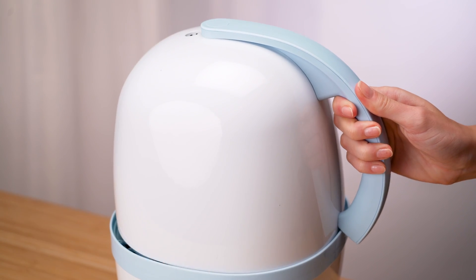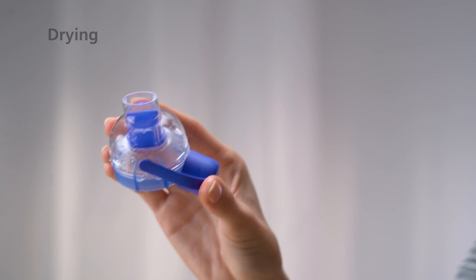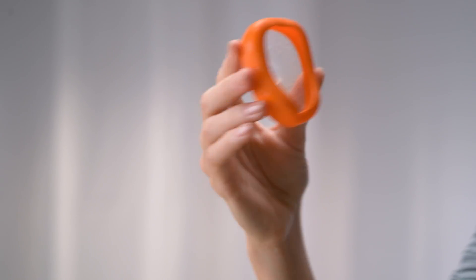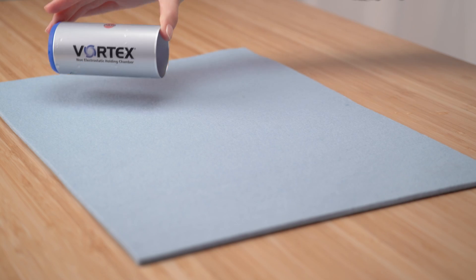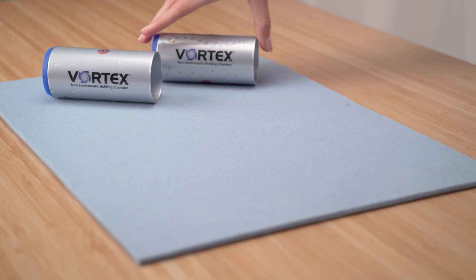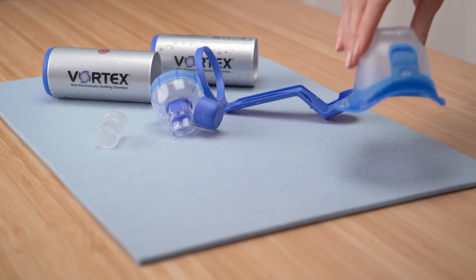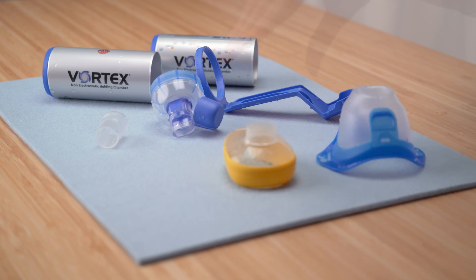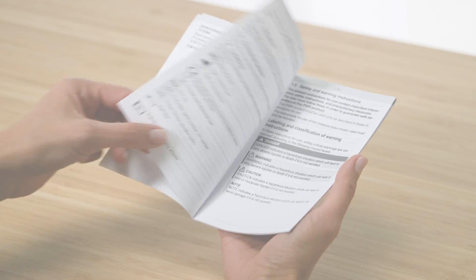Dry the individual parts directly after cleaning or disinfection. Shake out any excess moisture and ensure that there is no residual moisture in the parts. Place all parts on a dry, clean and absorbent surface and allow them to dry and cool completely. Please always observe the instructions for use when cleaning and disinfecting the Vortex.